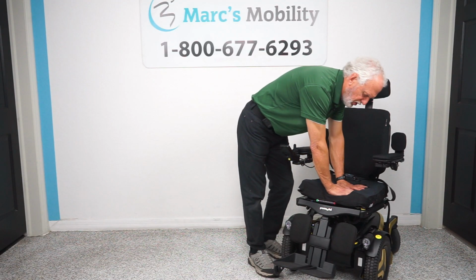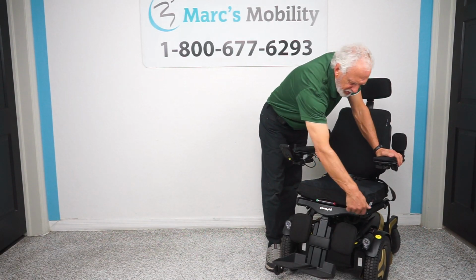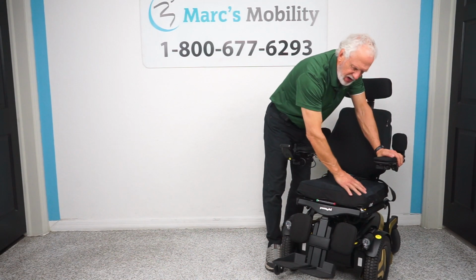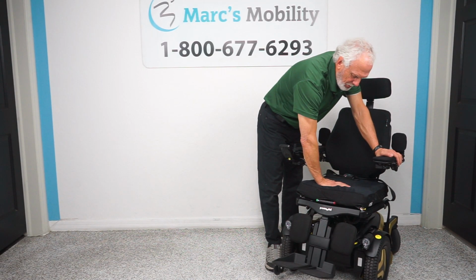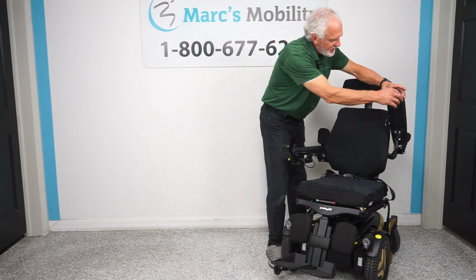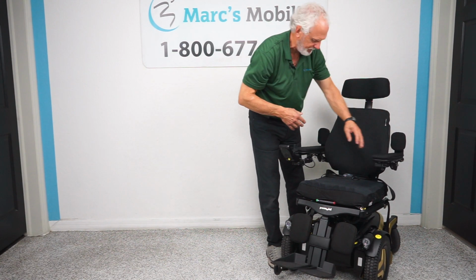This is a Roho cushion. This is an air cushion. It's got a little valve right here. If you unscrew this valve, we have a little plastic pump. You can put air in this cushion. You can adjust the pressure of the air in this cushion. This is one of the best cushions there is, okay? You have also right here a USB port. So if you want to charge your phone, there's a USB port right here to charge your phone.